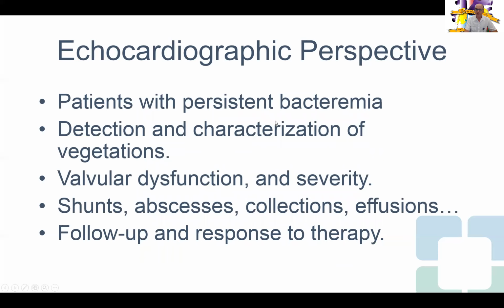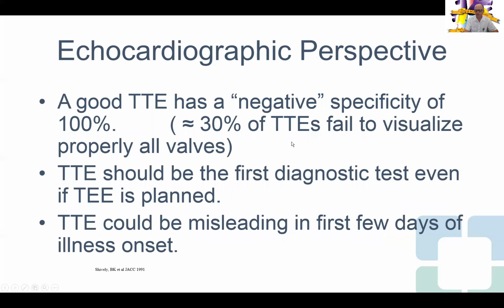Now, patients with persistent bacteremia, detection of vegetation, valvular dysfunction, shunts, and follow-up of response to therapy. These are the reasons why echocardiography is extremely helpful in these populations. From the beginning, it will follow the patient throughout the healing process and to the end of therapy.